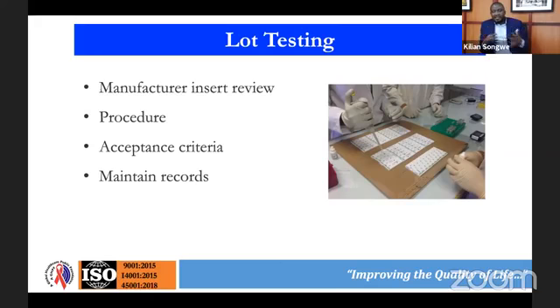So in case the lab does that, it has met the requirements, in case it's what it defined. Some other labs do it differently. They use statistical process control analysis to run the reagents that have just come in, and then do statistical analysis on them to ask themselves, is it still within the limits? So that is also acceptable.